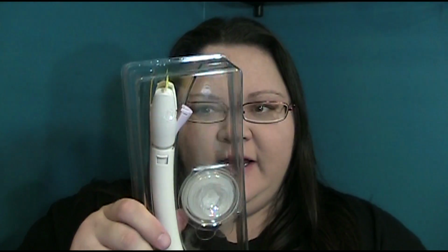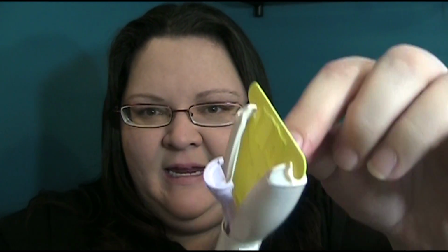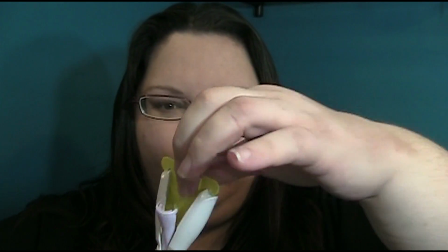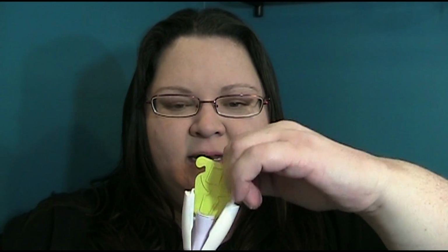Okay, so you have the condom part with a cervical cup in it, and then this plunger, you put the cup in here. Let's just pull it all out. So when you're ready to use it, you remove this, you place the cup in here, in that spot here. I wonder if I can remove this and put it back. Okay. So you'll place the cup in here, and you will not squeeze the white petals, you squeeze the purple petals to hold the cup in place, okay? I'm gonna put this back in here so it doesn't accidentally engage before I'm ready to use it tonight.